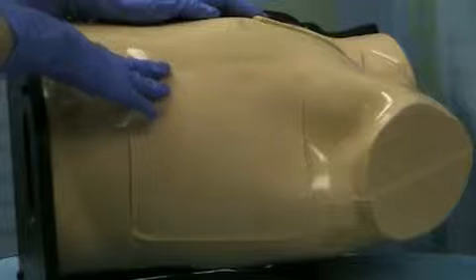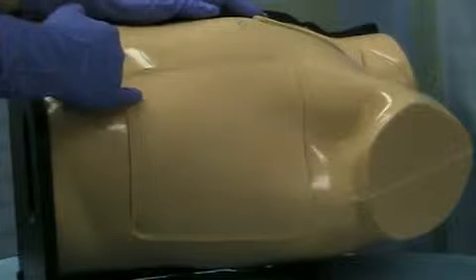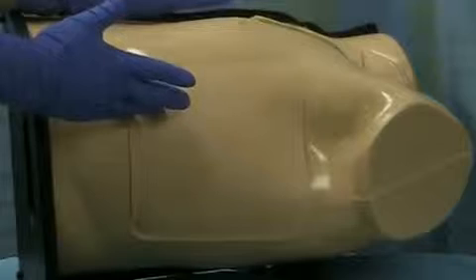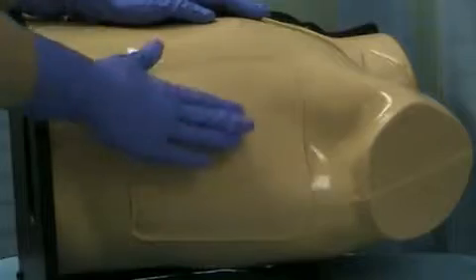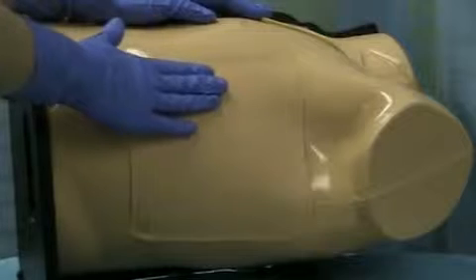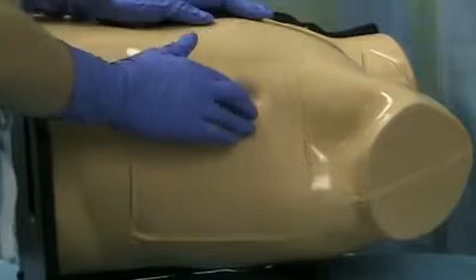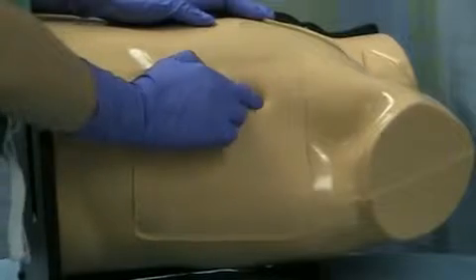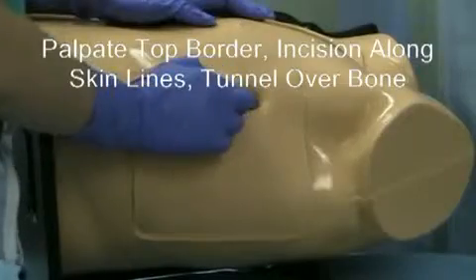This is done under sterile technique with the patient anesthetized on the skin using lidocaine, and then hopefully we've used a systemic relaxant and medication as well if the patient is awake and alert and talking to us. So we would go ahead and sterilize the skin with a prep, anesthetize it using lidocaine, and then go ahead and make our incision. An important thing in finding our landmarks for incision is to be able to feel the ribs, which on some patients can be more difficult than others. In this particular patient, I can feel a rib just there, so I'm going to make my incision literally on top of that rib so that I can tunnel over it.